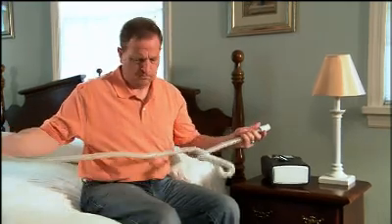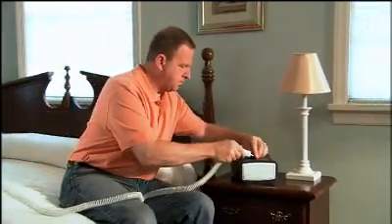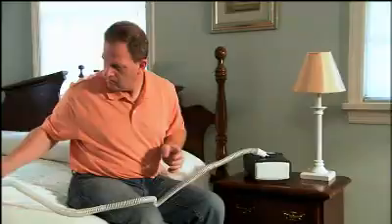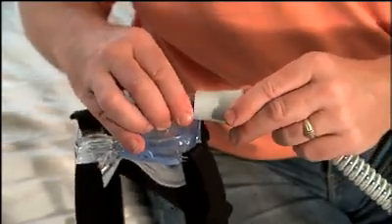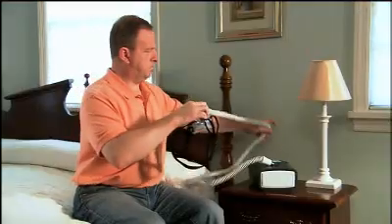Now attach the flexible tubing to the air outlet port on top of the humidifier, working the tubing into place until you have a good, secure fit. Connect the other end of the tubing to a mask and headgear. Refer to the instructions that came with your mask for tips on how to get a good, comfortable fit.